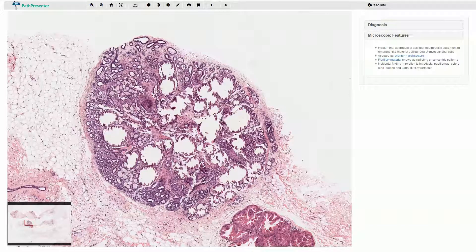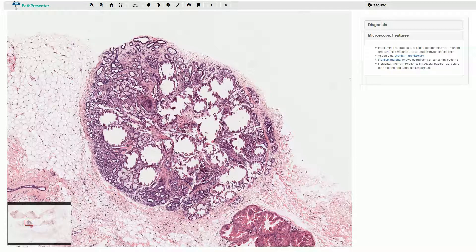Here we have a small nodular lesion of the breast which would be visible on mammography because we have these multiple calcifications here. However, this is not ductal carcinoma in situ. This is collagenous spherulosis.